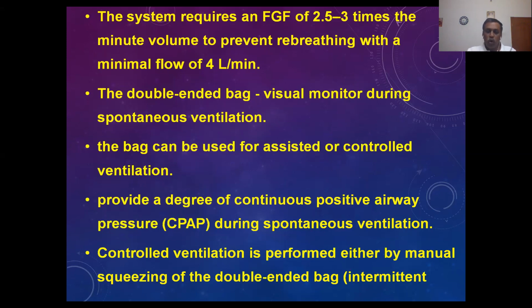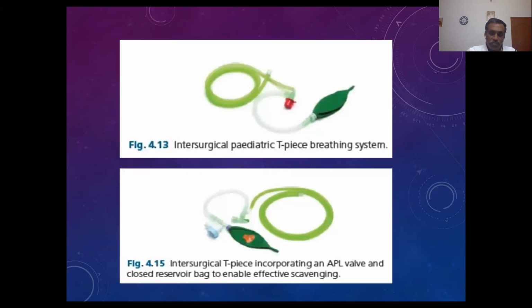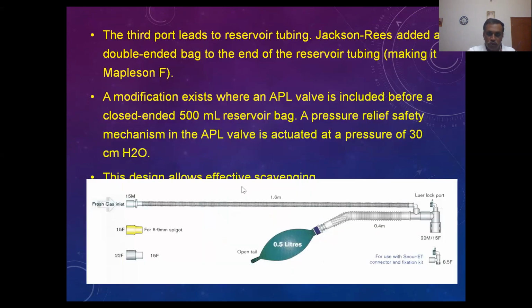And what should be the volume of the reservoir limb? This one is the reservoir limb. What should be its volume? The reservoir limb should be not less than the patient's tidal volume. That is the most important thing. The reservoir limb should be not less than the patient's tidal volume.